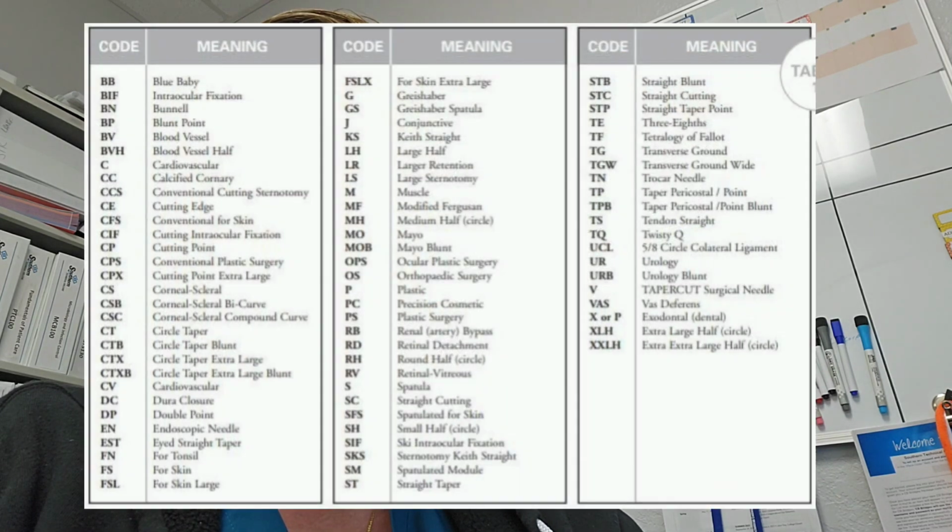And let's talk about codes. You can go on, but let's talk about CTX, right? That is really a CT, a circle, tapered. X on there means it's larger in size. You can have a CTX1, CTX2, CTX3. They just get bigger and bigger in sizes, right? Fascia typically are using these CTX. So when you think CTX, you're thinking of fascia or abdominal closure, in my opinion.